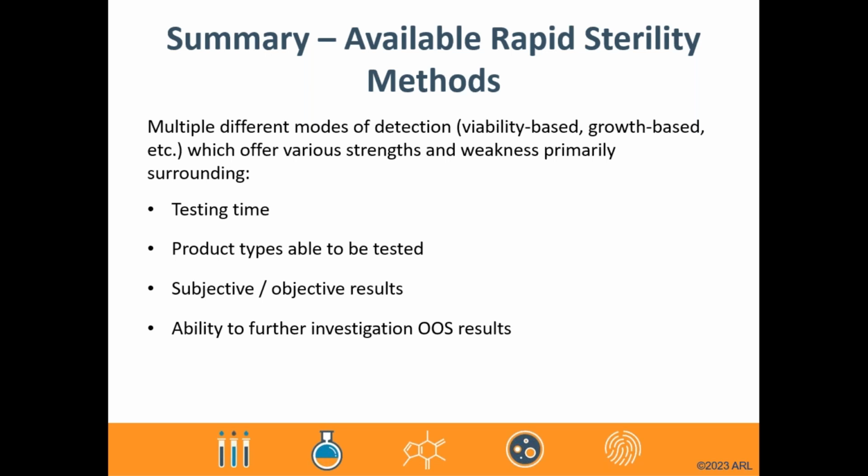and finally, the ability to further investigate out-of-specification results. Is the microorganism able to be identified once contamination is suspected? These are all factors to take into account when deciding which rapid sterility test method best meets your needs.